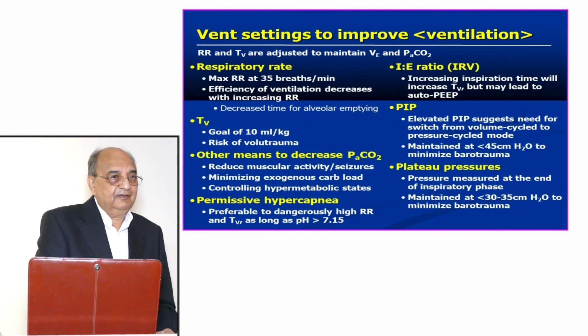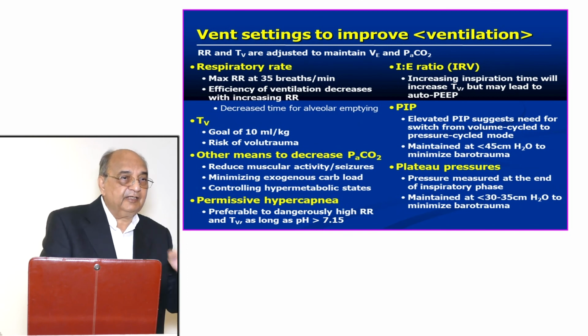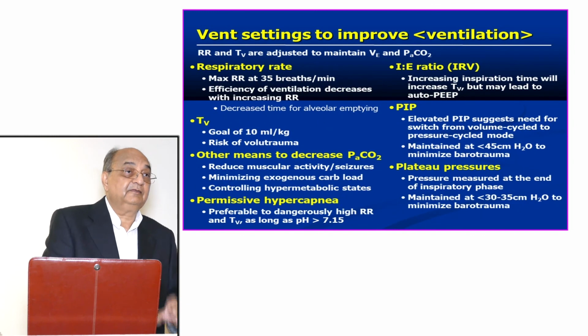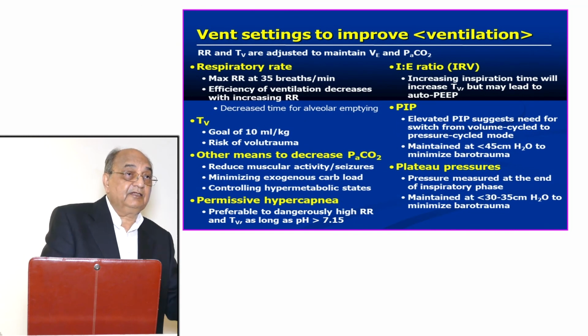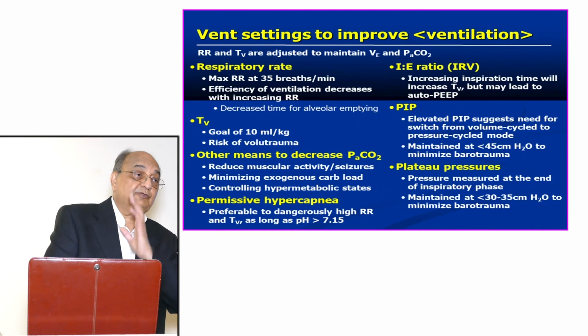So the first thing which improves it is the rate. You have to fiddle around with the rate of ventilation. You increase the ventilatory rate. And the second thing is the tidal volume. You increase the tidal volume and you increase the rate, and it will wash out the CO2.